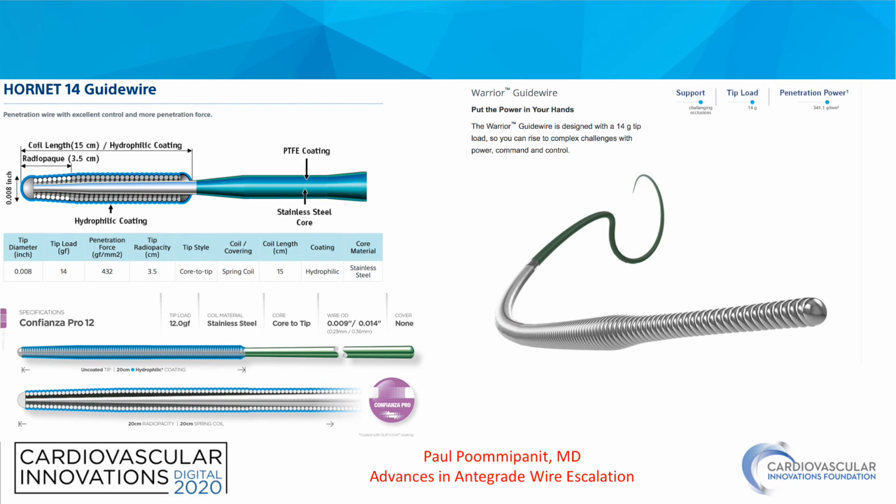I will advise that if you're going to use this wire to cross a proximal cap, make sure to de-escalate after you cross the cap. So in typical fashion, you penetrate the proximal cap with this wire, you move your gear past the proximal cap, and then you de-escalate to an intermediate weight polymer jacketed wire to traverse the rest of the lesion. If you push on these wires hard enough, they will go somewhere.